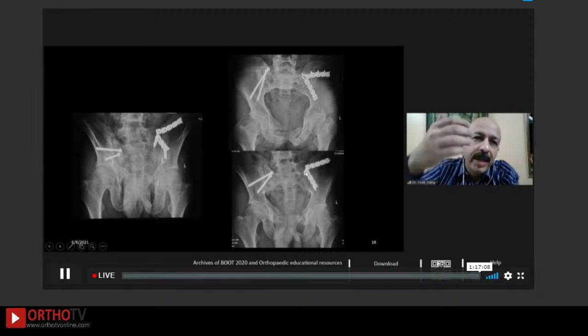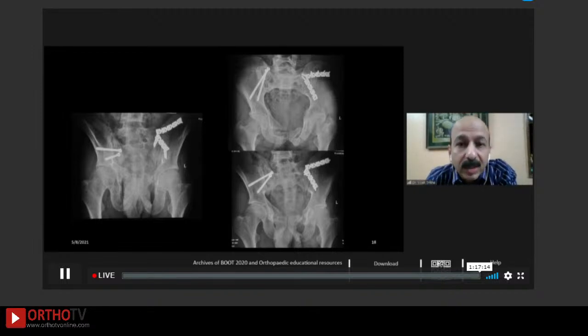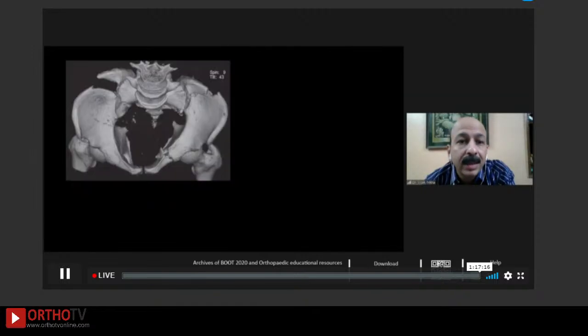We always went anteriorly, looked at the thing, looked at the nerve root, ensured that we are not pressing it, and made sure there is no vascular injury which can happen out here.